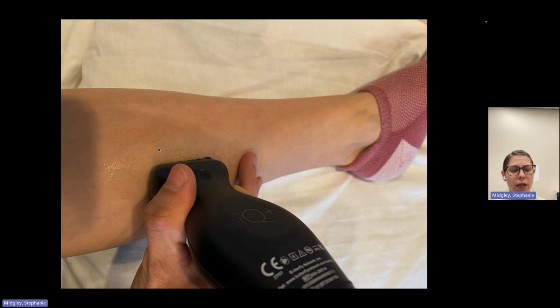One, it lets your eyes adjust and focus on what's normal, versus plopping into the middle of abnormal, which might be disorienting. Two, it gives you an idea of where that line goes from normal to abnormal. And three, if you plop the probe where it hurts the most, that patient is probably going to punch you and not let you go near them again. So if you start further away where it doesn't hurt and slowly get to the area of pain, they're going to tolerate it much better.